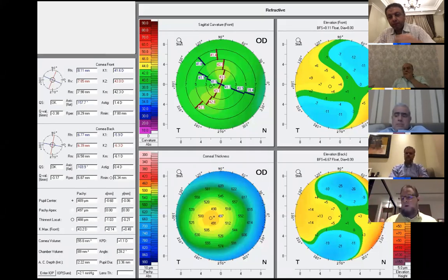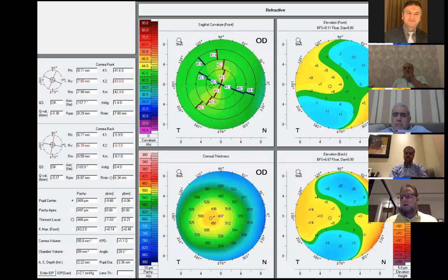With the small white to white, especially since the patient has axial hypermetropia in the right eye, which means white to white is small, in this case I avoid it. In addition, usually I don't treat more than +4 with LASIK. I may go for a lens-based treatment. So these are my points about this.